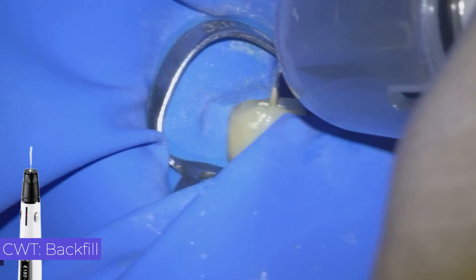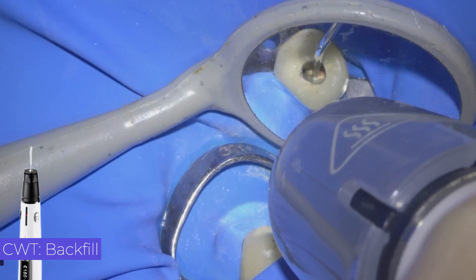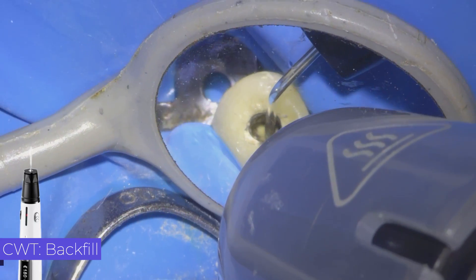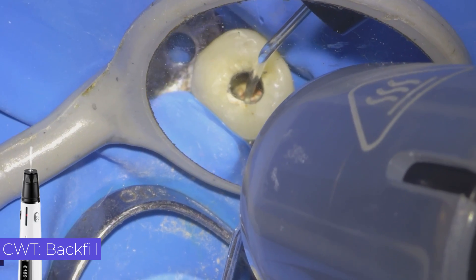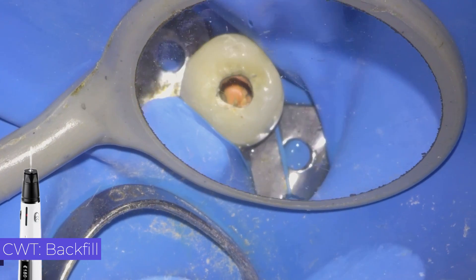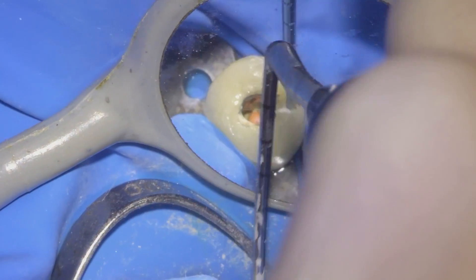We perform the obturation of the middle and coronal third of the canal with thermoplastic injection. It can be filled in increments of 3 or 4 mm or in one step. It is quite common to create gaps, which are usually easily resolved with thermocompactors.